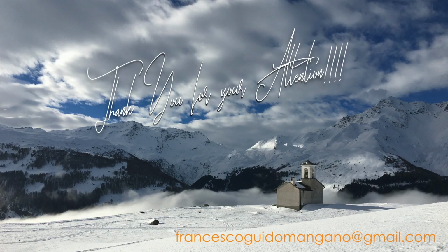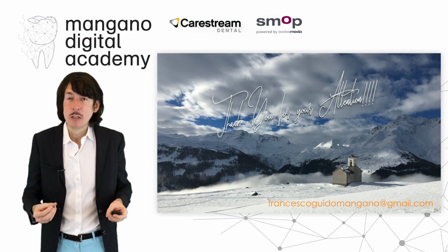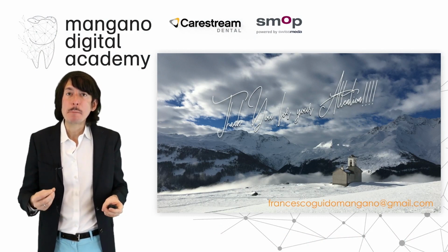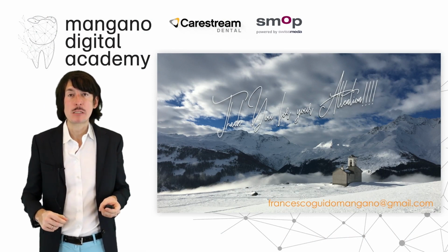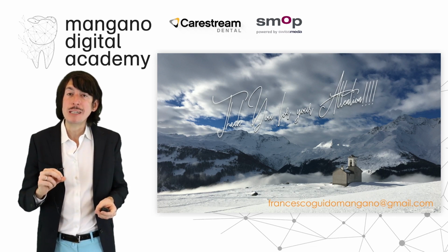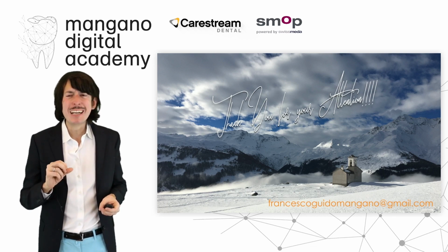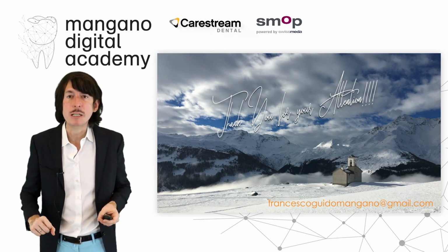So thank you very much for your kind attention. These are very difficult concepts, but basics for modeling proper, precise implant supported restoration, particularly in the complex cases, particularly in the full arch. The congruence is very important. We are not talking only about the accuracy of an intraoral scanner, we are talking about the congruence. Thank you very much for your kind attention.